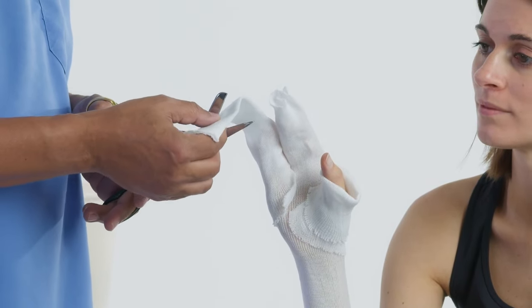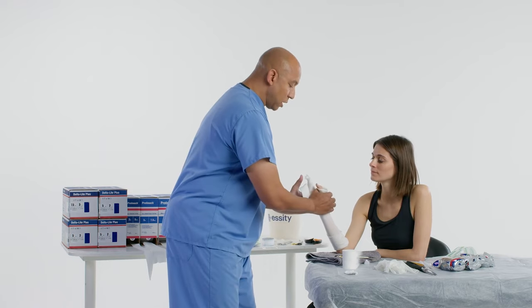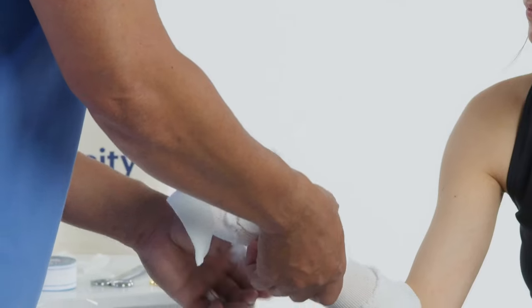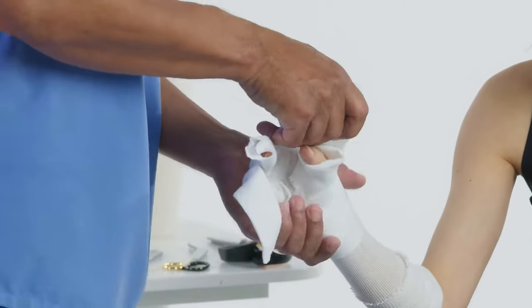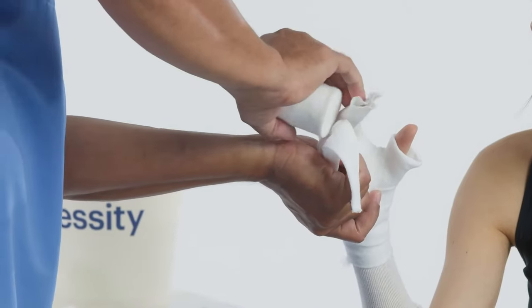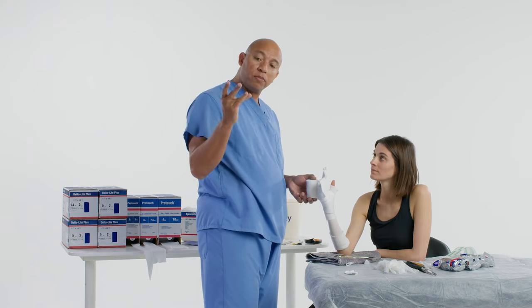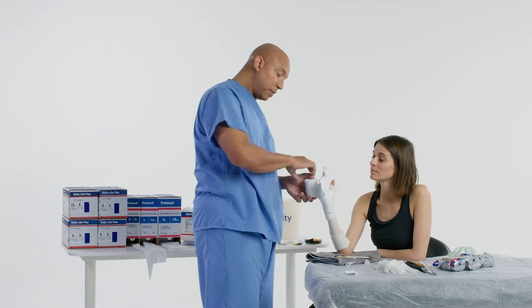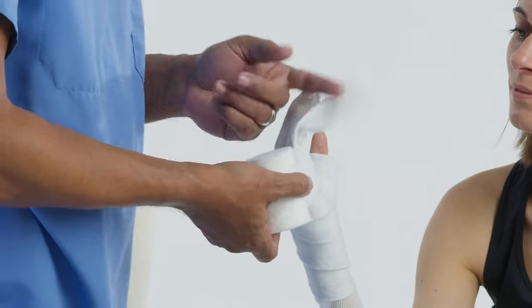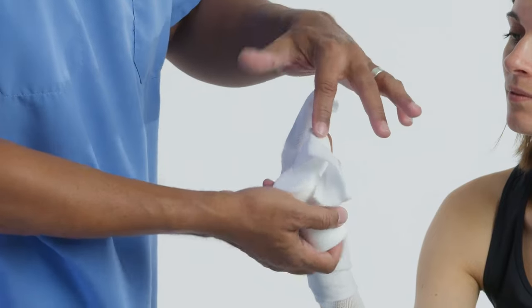Have a little extra there, so let's cut this off. Now again, let's establish that position one more time. I'm quickly trying to get up to the fingers area, so I want to go between the fingers and get this nice and smooth. One of the common problems people face when putting these casts on is placing them too deep in between the webbing of the fingers, which causes a lot of irritation. I'm tearing the material so I can get between the fingers a little bit easier. Palpate on the tips of the fingers to know where your cast will terminate.